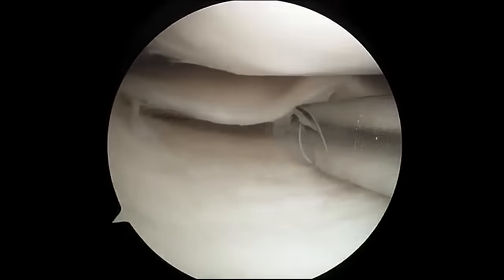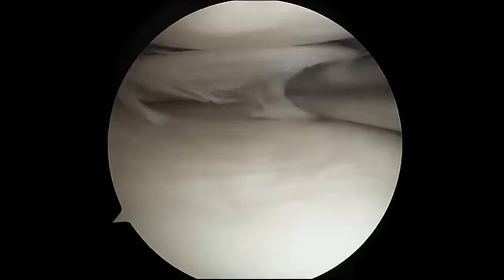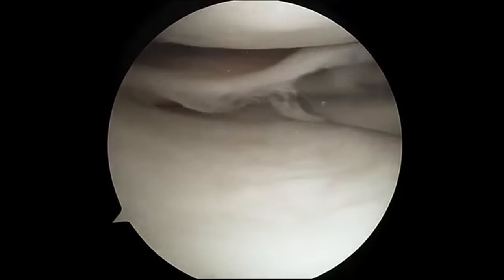This is our shaving instrument. It can remove portions of the meniscus. It has a suction device as well as a small oscillating blade that helps to remove the torn edges.